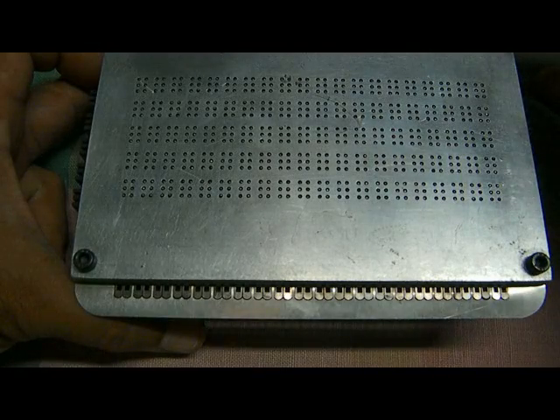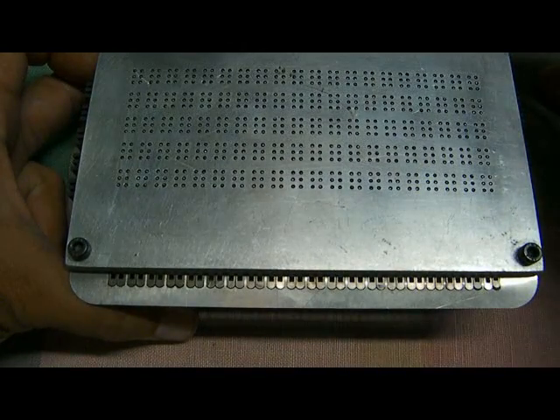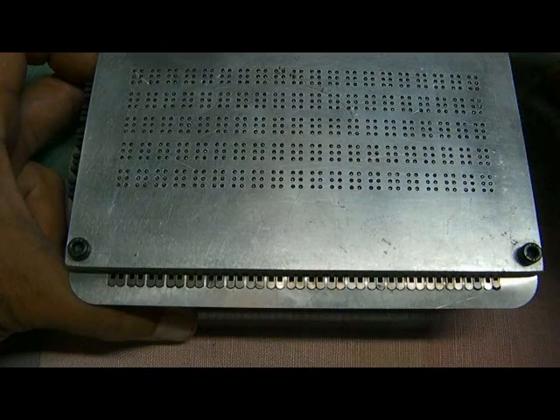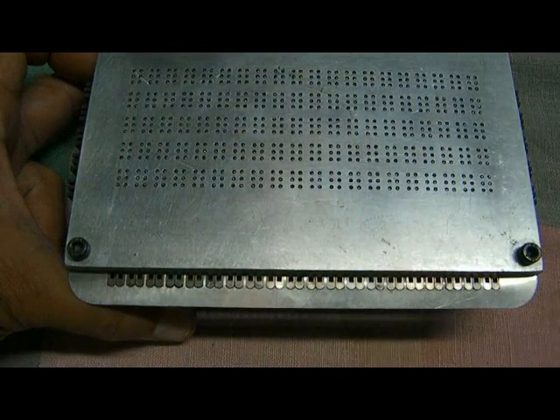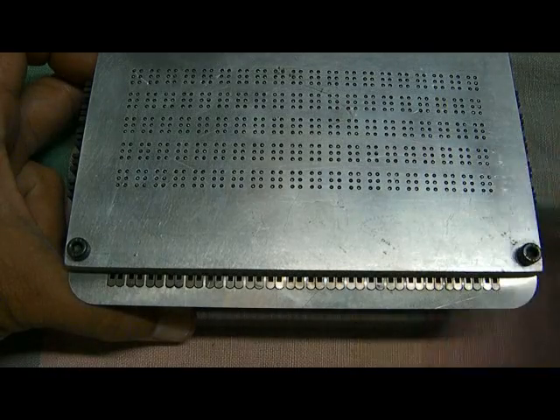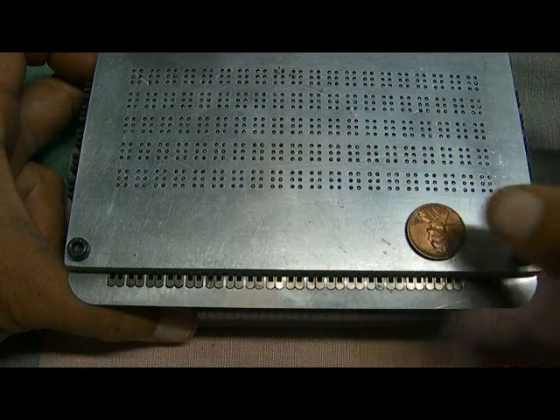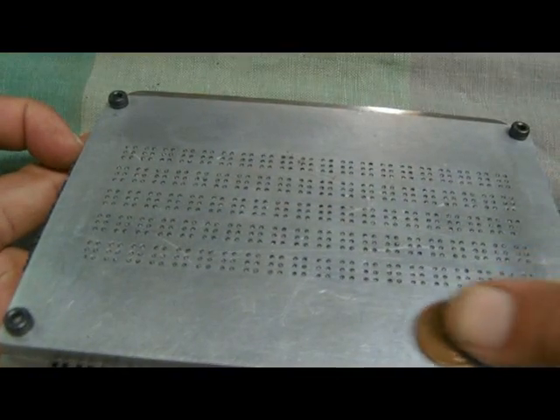You can see in the bottom right corner of the screen is just that 0.5 millimeter gap over here that opens and closes. That indicates a closed or latched column. This is an open or unlatched column. So right now all the columns are open, so that any pin can be enabled in any order, any row, any line. So what I'm going to show you is, now I'm going to zoom in a little bit.